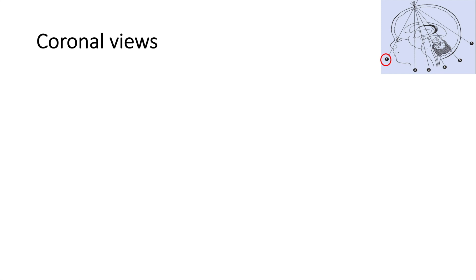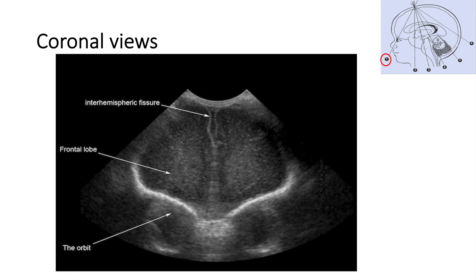Now we're going to move to the coronal view. We're going to see the frontal lobe — this is the right side and this is the left side — and this is the interhemispheric fissure.